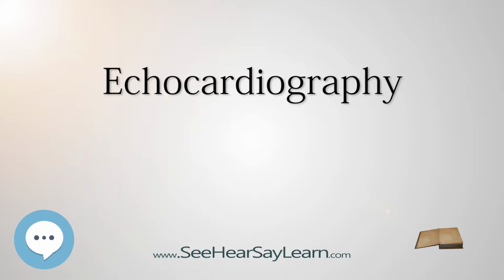Color Doppler, as well as spectral Doppler, is used to visualize any abnormal communications between the left and right sides of the heart, any leaking of blood through the valves, valvular regurgitation, and estimate how well the valves open, or do not open in the case of valvular stenosis.